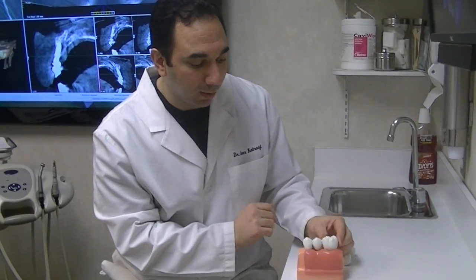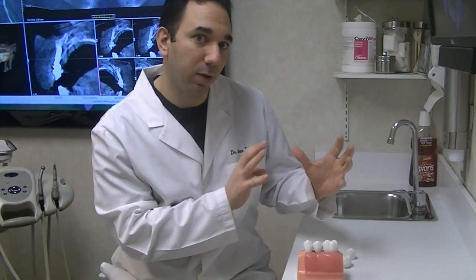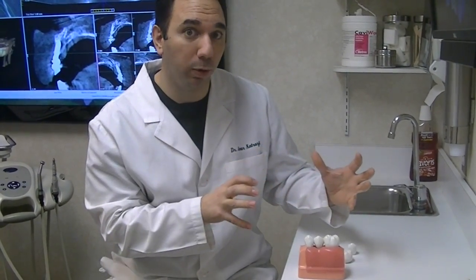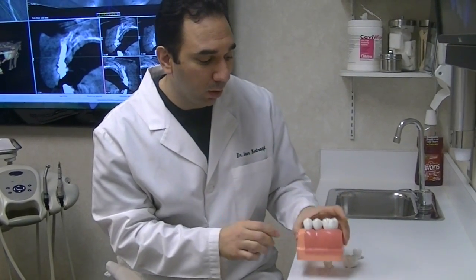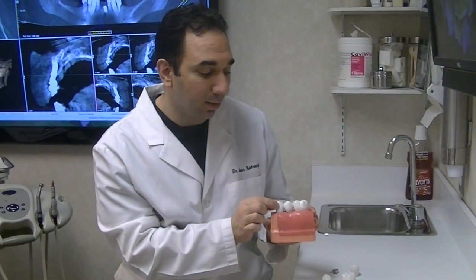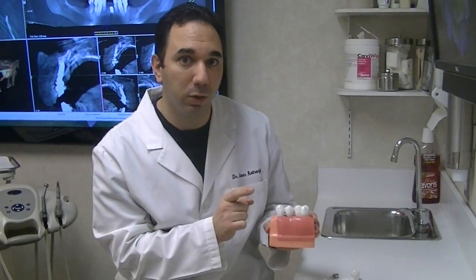What's very interesting about an implant is it separates the teeth. If something happens to one side of a bridge, it happens to the whole bridge. With an implant, you don't have to worry about that. Another thing we really like about implants is that the loss of bone that happens still occurs with a bridge, whereas with an implant, the implant maintains the bone.